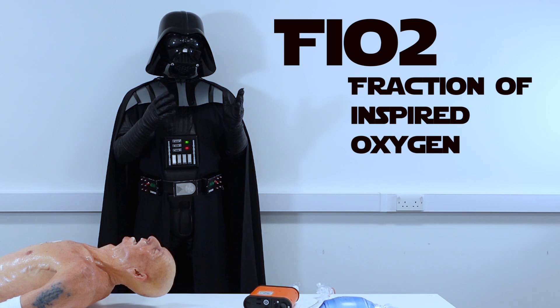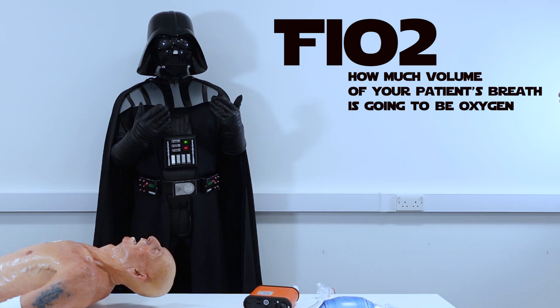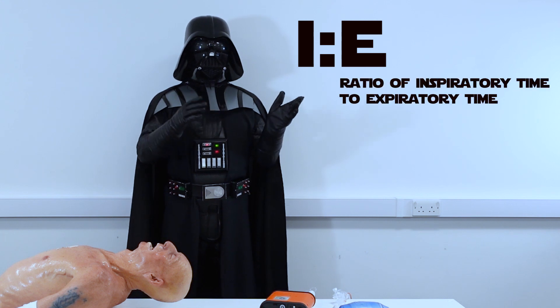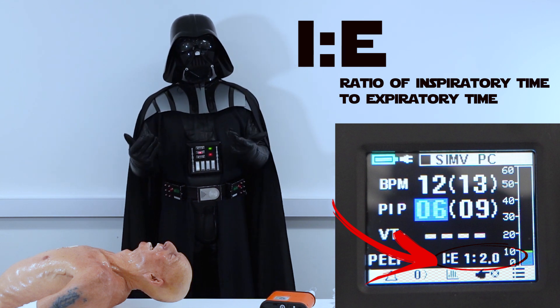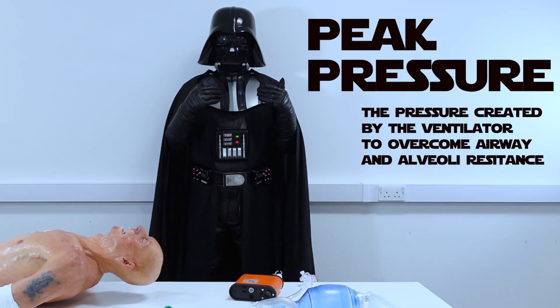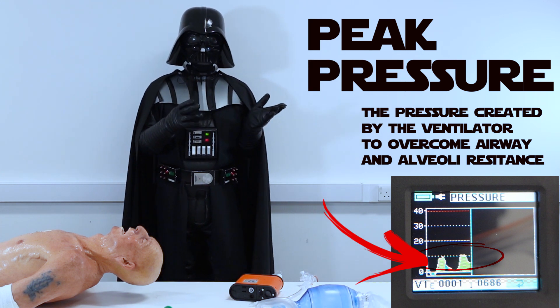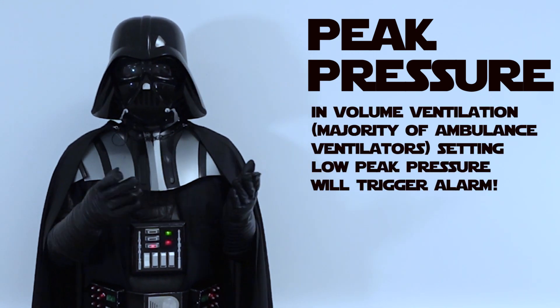FiO2, fraction of inspired oxygen, is how much of your patient's breath will be oxygen — usually set anywhere from 50 to 100%; mine is set to 100%. I:E ratio — inspiration to expiration ratio — is usually set to 1:2 which mimics physiological respirations, but you can come across 1:4 or even 1:5, usually in asthma or COPD patients. Peak inspiratory pressure is the pressure created by the ventilator to overcome airway and alveoli resistance to deliver the desired tidal volume. It is set very individually, but in ICU patients you will usually come across values of 20 to 30. It matters predominantly in pressure-controlled ventilation; in volume-controlled ventilation it will just trigger the alarm.